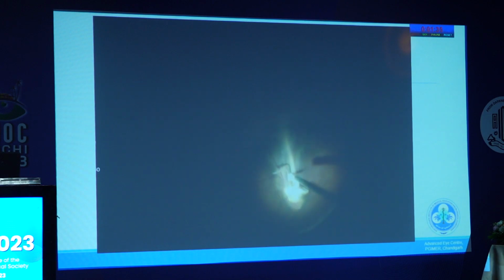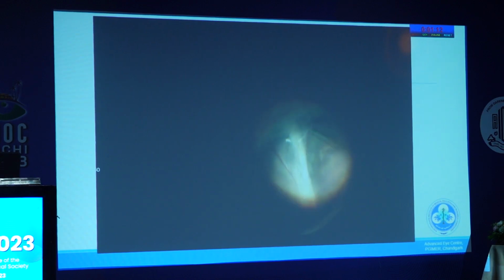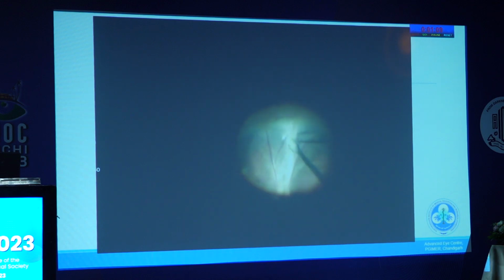The intraoperative OCT helped me to delineate the vitreous membrane that was there between the folds. I do use triamcinolone because it helps to identify the small amount of vitreous separation which may be present in such cases. We don't need to induce the posterior vitreous detachment (PVD) completely, but at least in the posterior pole, if we can do it, it does help to give a better result in terms of anatomical success.